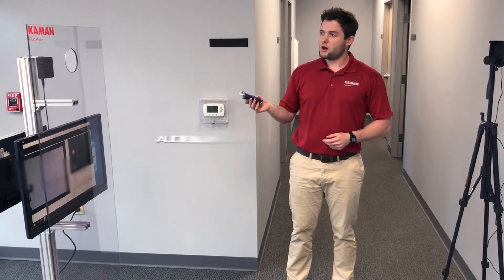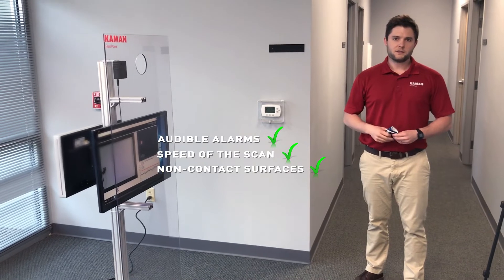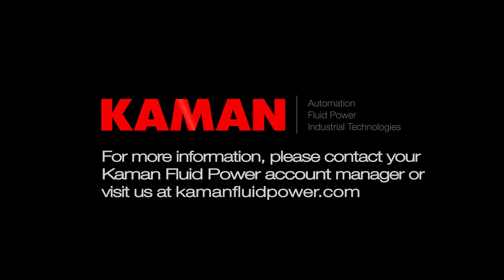The audible alarms, the speed of the scan, and the non-contact surfaces make this the best solution as you start up your manufacturing processes and get back to work. Please call your local Kaman Fluid Power location for quotes or our FAQ, which will help answer any question that you didn't even know you had. Thank you for your time.